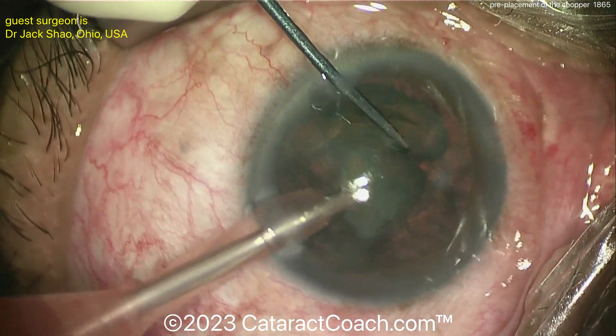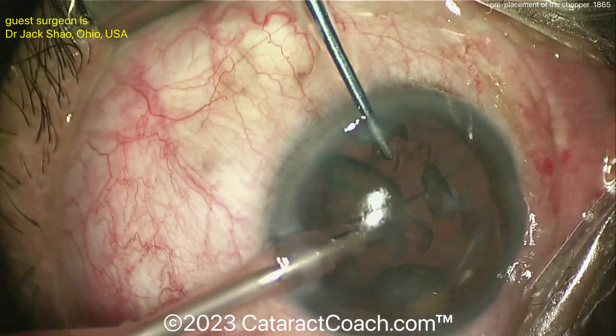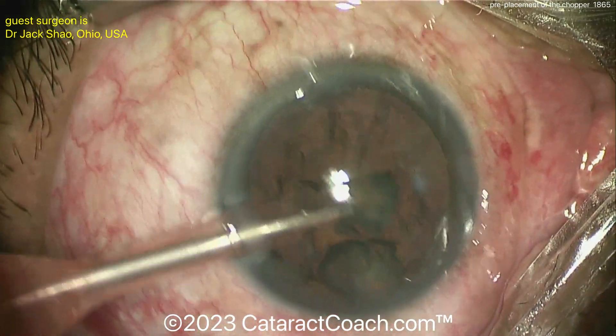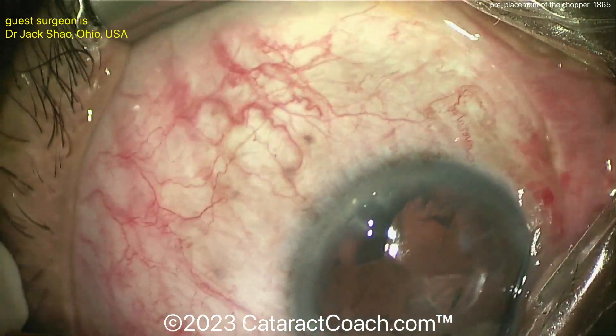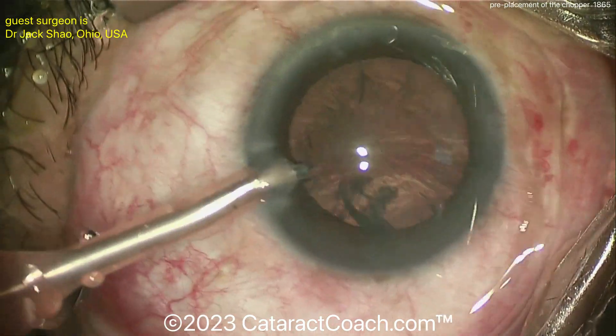Bring the FACO chopper tip towards the probe, then split them apart and propagate the chop. The rest of the case is easy. Once you have that first chop, the trick is the first chop — because once you have it, the rest is easy. In fact, in a lot of my videos, as soon as I make one chop and get two nuclear halves, I'll just wolf them down and call it a day.